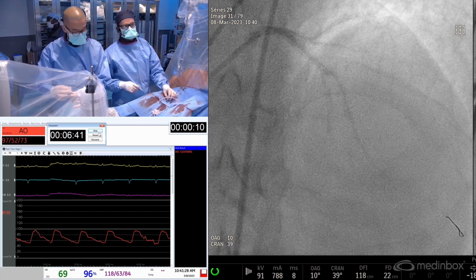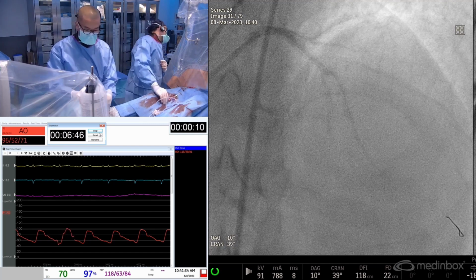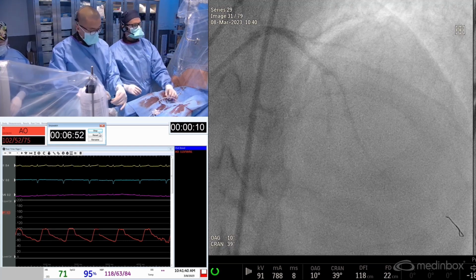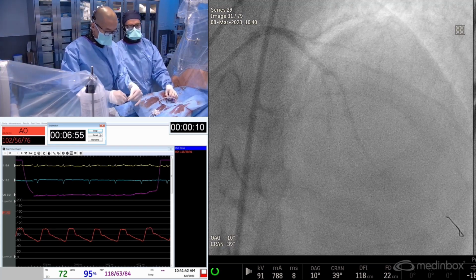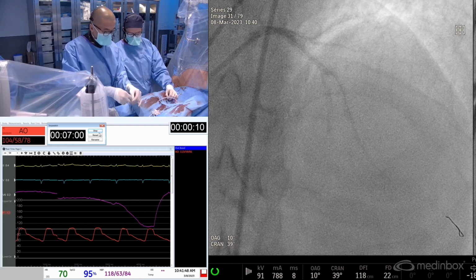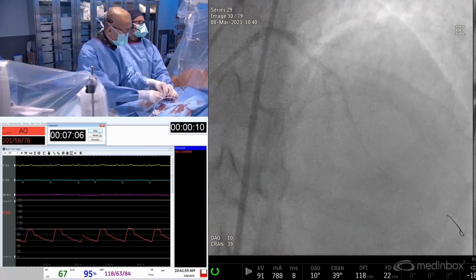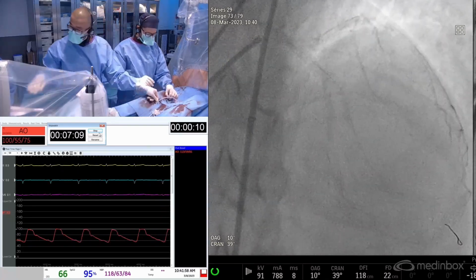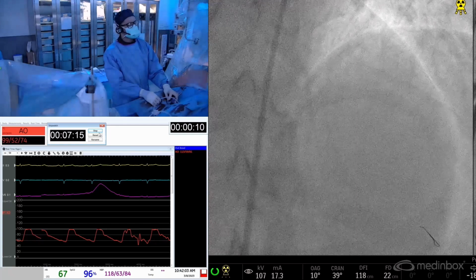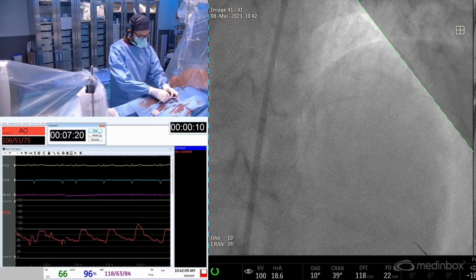So the other thing is that IVL will allow you the ultimate parameter, intracoronary imaging parameter that you want, which is stent expansion. However, it doesn't necessarily favor delivery. So this is where I think atherectomy strategies are complementary, and rotational atherectomy will get rid of all these spicules as well as a bit of the subintimal, not really the subintimal calcium, but some of the intraluminal calcium that will prevent you from getting stent delivery.